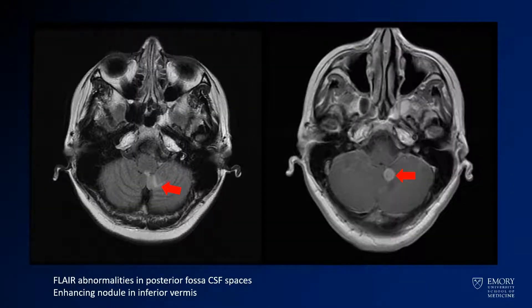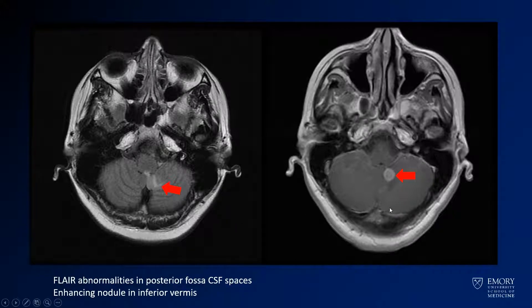Here you see the MR, which confirms that this finding is real. You have abnormal FLAIR signal here in the inferior left cerebellar hemisphere and vermis, and you have an enhancing nodule adjacent to it.